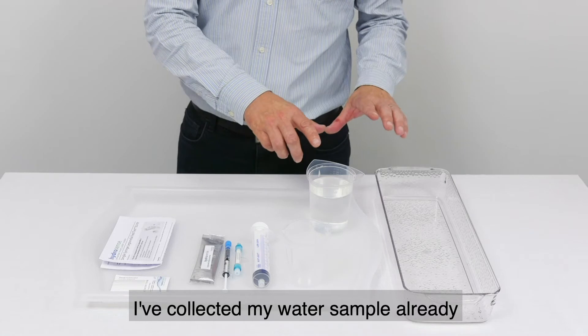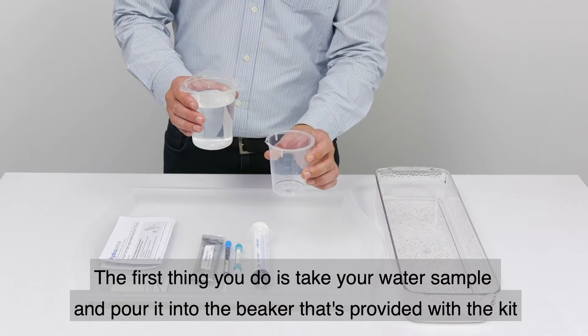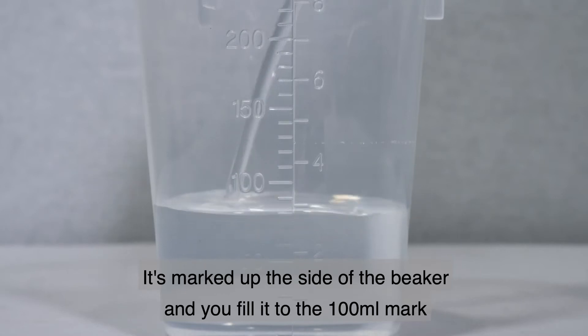I've collected my water sample already. The first thing you do is take your water sample and pour it into the beaker that's provided with the kit. It's marked up the side of the beaker and you fill it to the 100 millilitre mark.